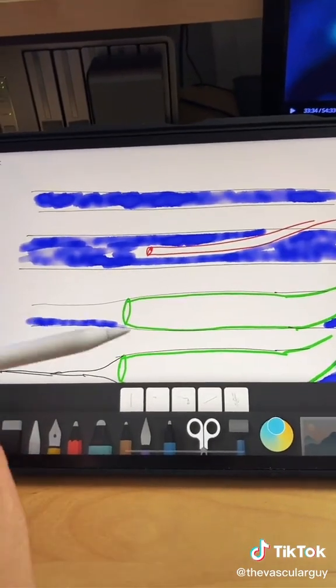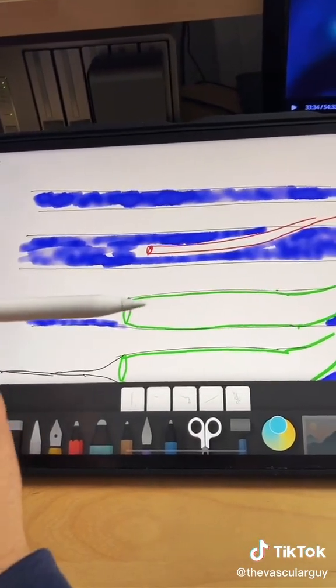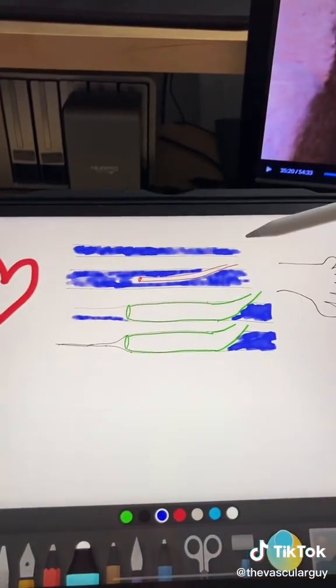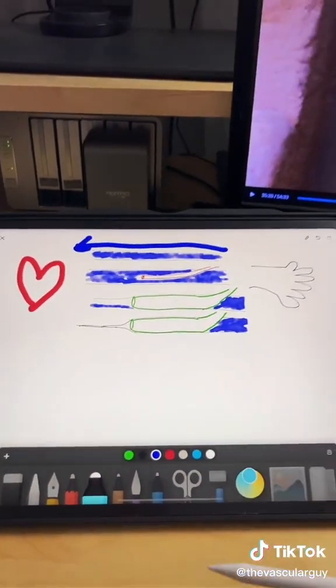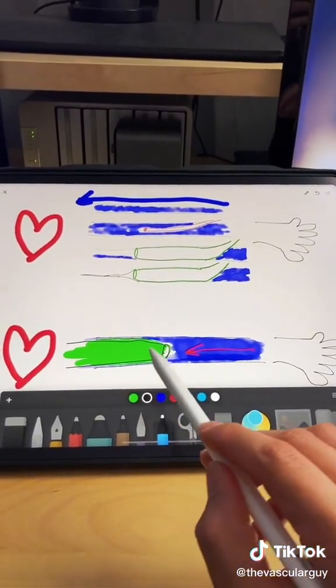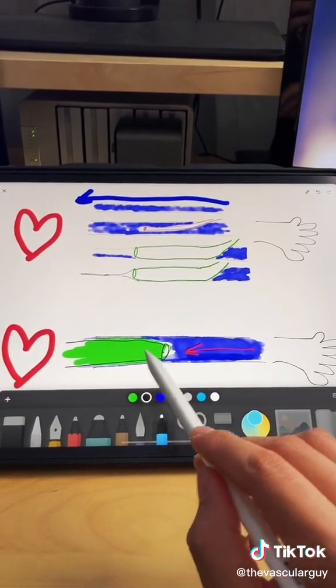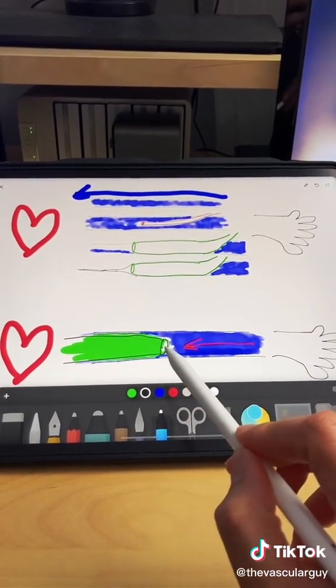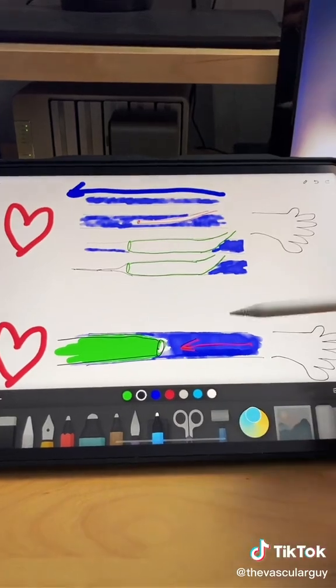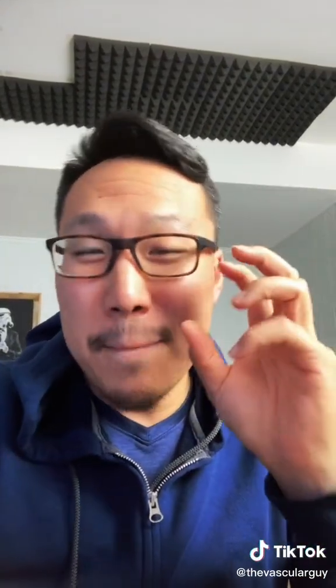Now let's talk about what happens if the catheter goes the other direction. In the previous video we had blood flow going from the extremities to the heart. So here is what it'll look like when you have the catheter pointed towards the extremity and not towards the heart — you're going to have the opening pointing at the flow of the blood return. If that's pointed towards the way the blood flow is going, maybe that will be one way that we can draw blood.